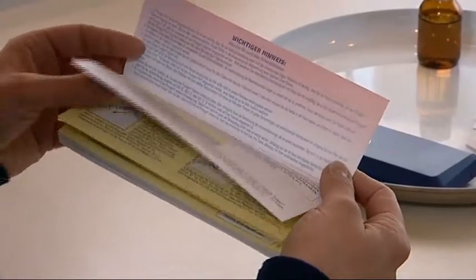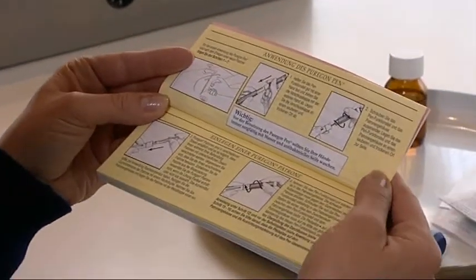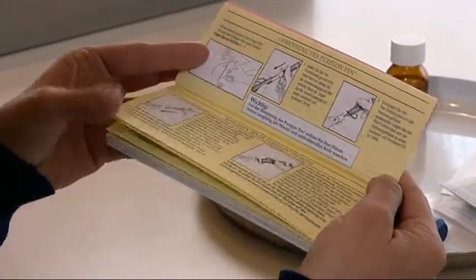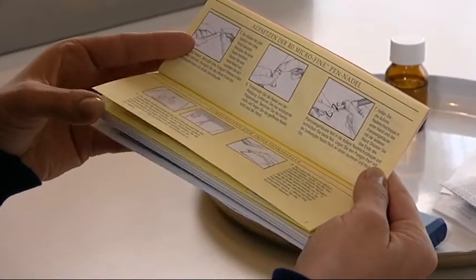Note that some of the wording in the Puragon booklet specifically addresses the major group of users who are on a daily treatment regimen. If your doctor has given you other instructions on your treatment regimen, always follow his or her instructions.